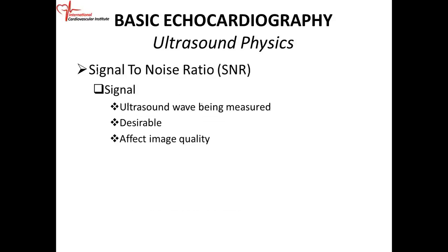When you say dynamic range, it just means the different shades, and you want to make sure that you can distinguish them. You don't want them to all look alike, because the tissue clarity or the image clarity is not going to be very great.